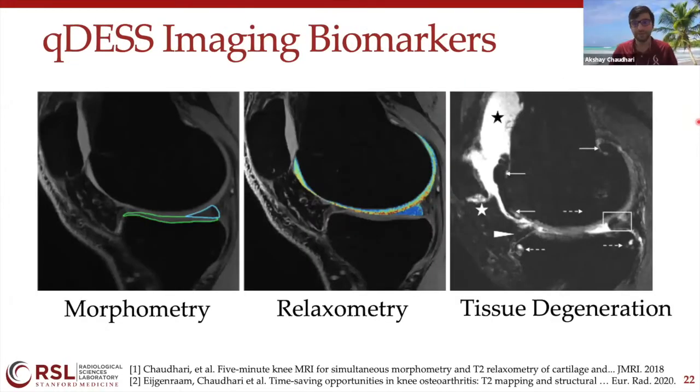Yeah, that's a good question. In this case, we're talking about imaging-based biomarkers that we can assess non-invasively. Essentially, when we say biomarker, we're looking for a specific imaging-based outcome that we can use to assess longitudinal progression and change. There are a few different markers like this that we're using. And this T2 relaxation rate is probably the most commonly used biomarker in the context of osteoarthritis activity, because like I mentioned, it's sensitive to early collagen degeneration. There have been a whole range of different studies that really evaluate the fact that this T2 changes in response to acute injuries or different remodeling processes within the joint space. So that is actually what we tend to use most often.